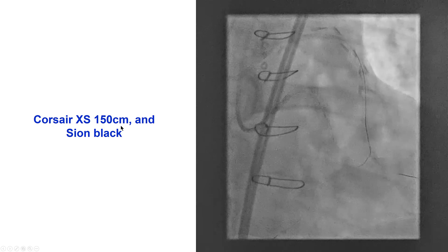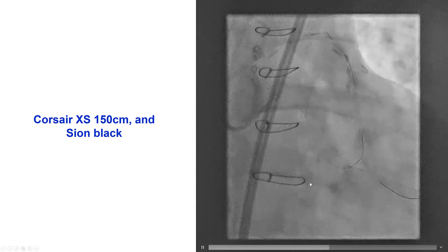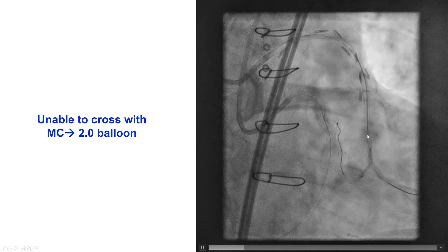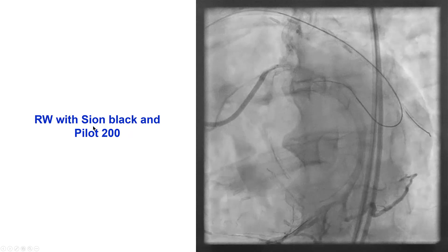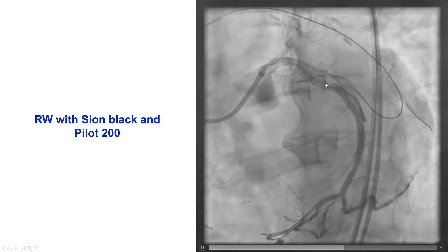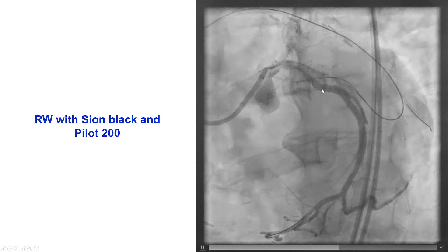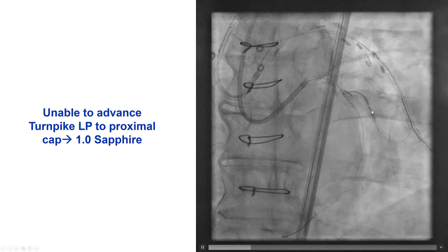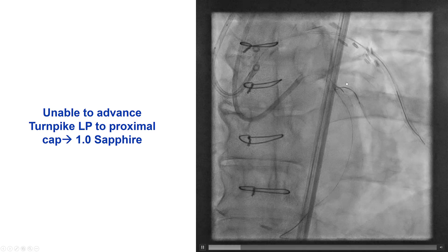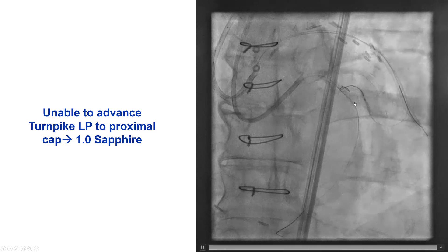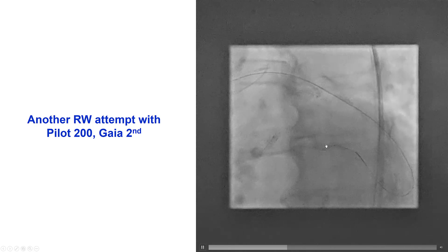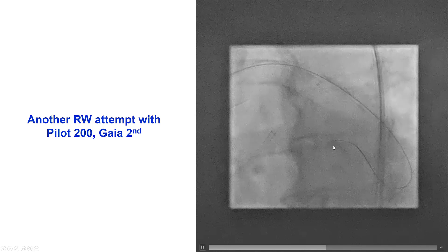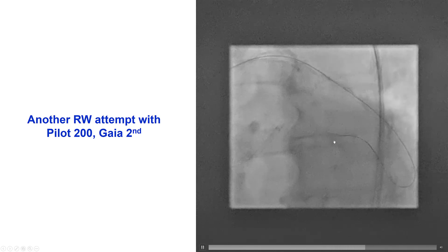We used a Corsair XS 150 cm microcatheter and a Confianza wire that easily went retrograde. However, the microcatheter could not cross, so we had to balloon across the distal anastomosis to advance the retrograde microcatheter. We tried advancing a Confianza and a PILOT200 retrograde, but they seemed to go in the extraplaque space — we see the wire wrapping around the circumflex stent. We had difficulty getting the retrograde microcatheter closer to the cap, and to overcome this we did balloon angioplasty with a Sapphire 1.0 mm balloon advanced retrograde.